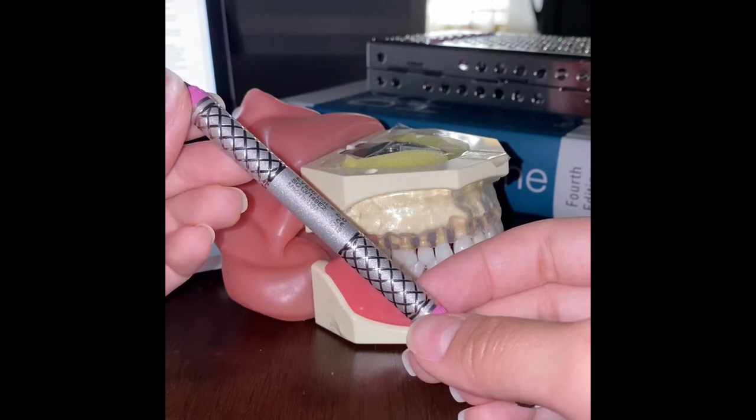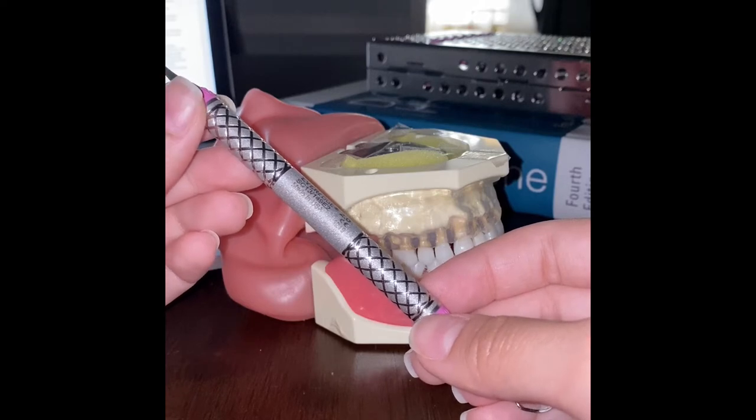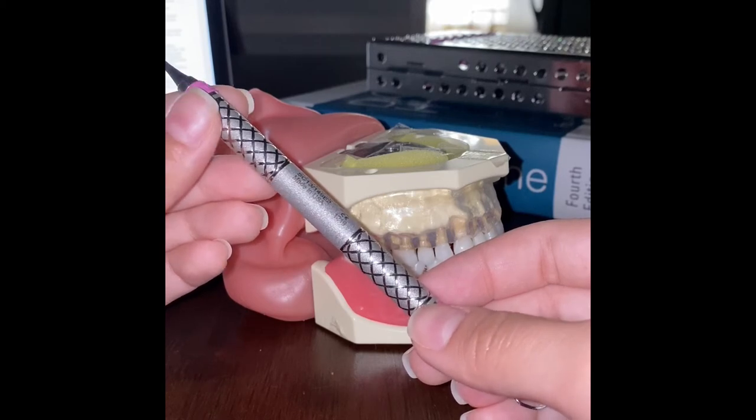Once we reach the bottom of the sulcus, we open the face of the blade — meaning the tip of the blade is away from the tooth — at a 60-80 degree angle. We activate the instrument using controlled short overlapping strokes. The working end should remain beneath the gingival margin at all times.